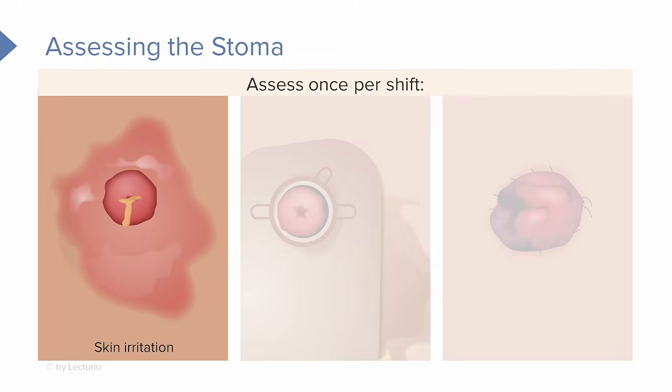If you take a look at that upper stoma with the red ring around it, any stool or feces or urine that gets on the patient's skin can cause really bad redness and irritation. You can imagine, just like your hands in the winter, if there's dry, cracking, redness, it's really painful and not good for the integrity of the patient's skin.